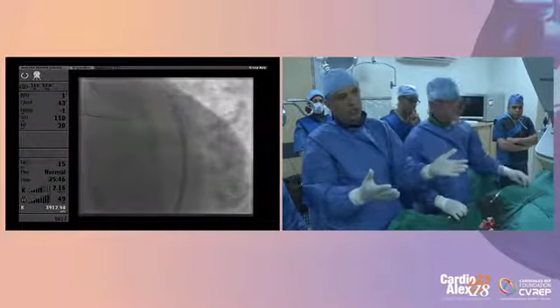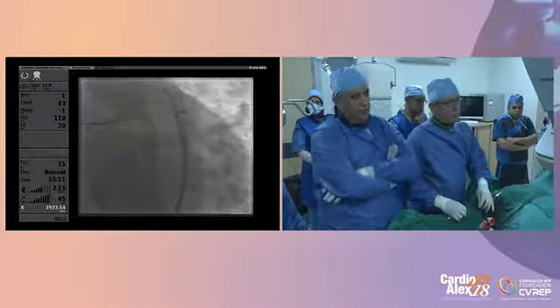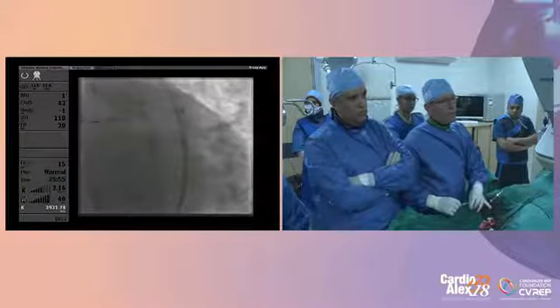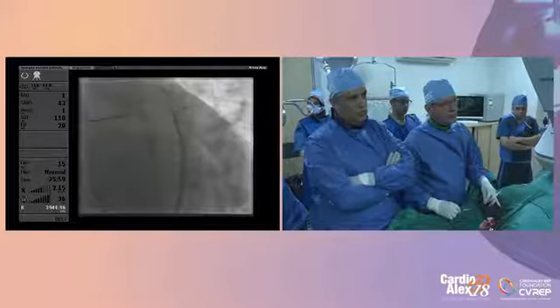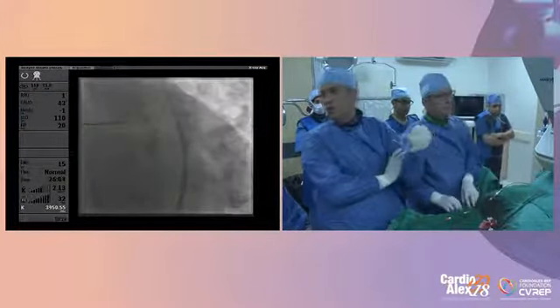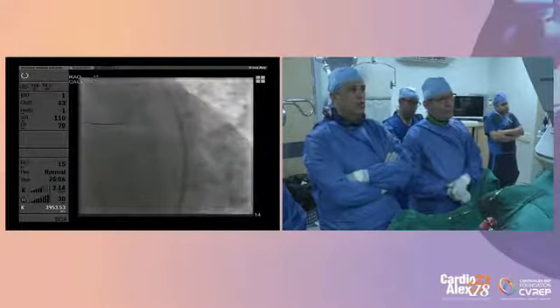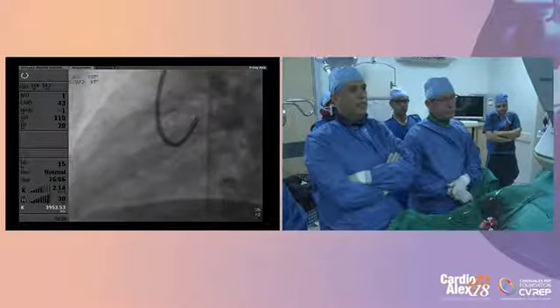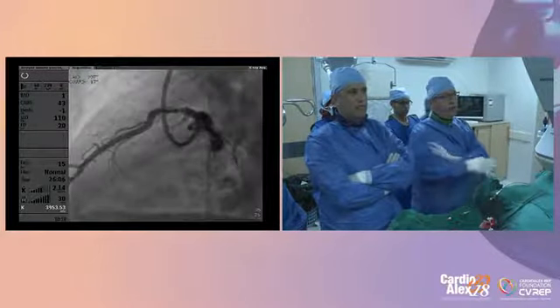So did you suggest any solution in such situation? Now we have Gaia Second and FineCross. Okay. Can we show the angio? Can you see the angio of the left system? I think this ramus is a CTO. It's a chronic total occlusion with a long-standing duration.